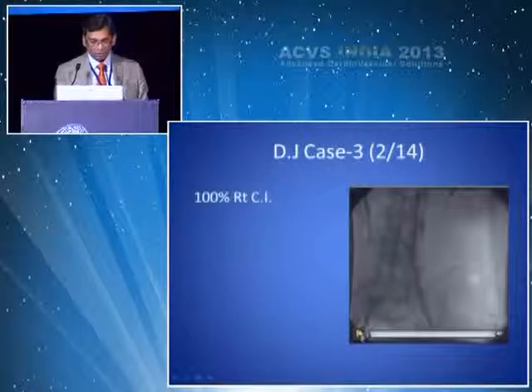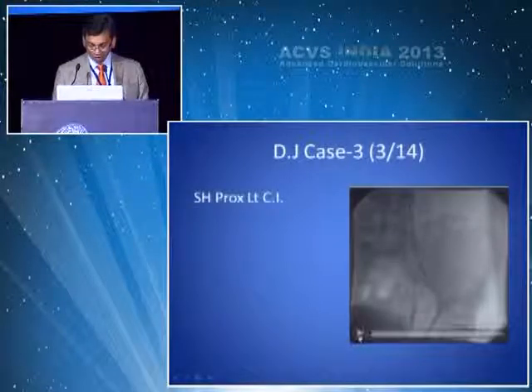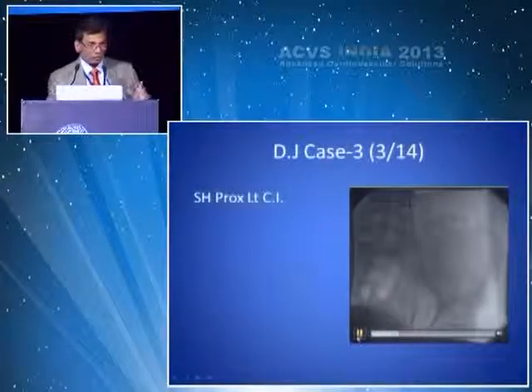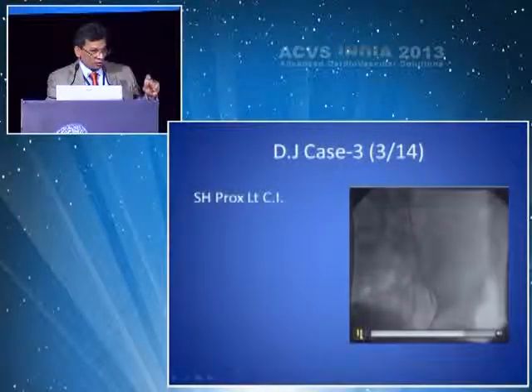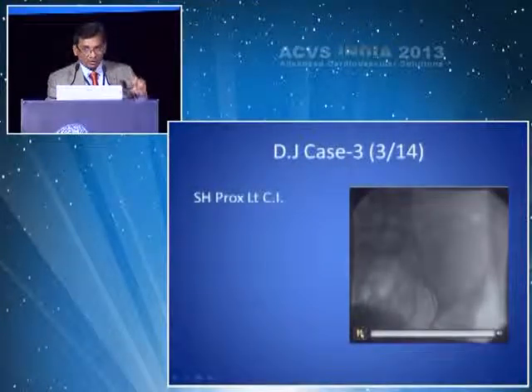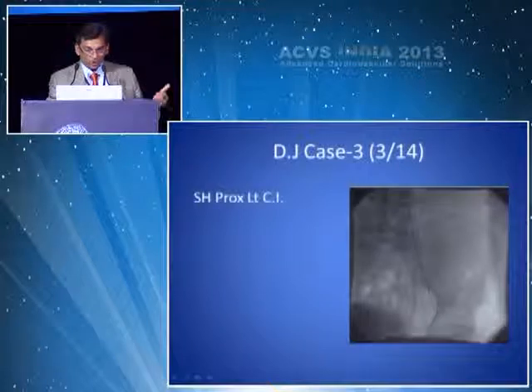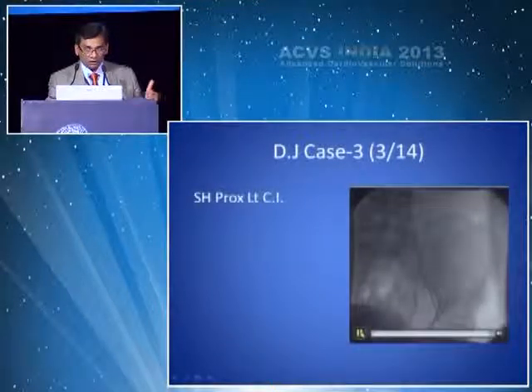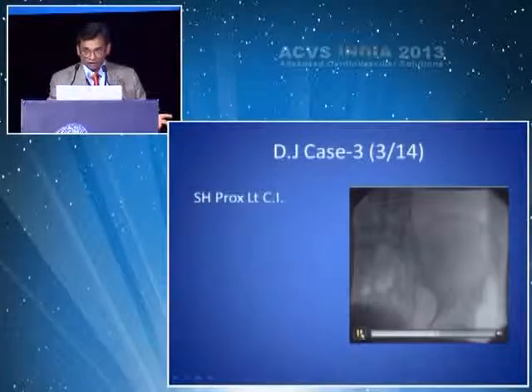He has a totally occluded right common iliac. Next. As you saw, there were two lesions, one proximal and one distal, to the fem-fem graft. And then there was distal disease, which, if you have to balloon or stent this, you would either lose the fem-fem graft, or in the joint area there's high risk for stent fractures and thrombosis.